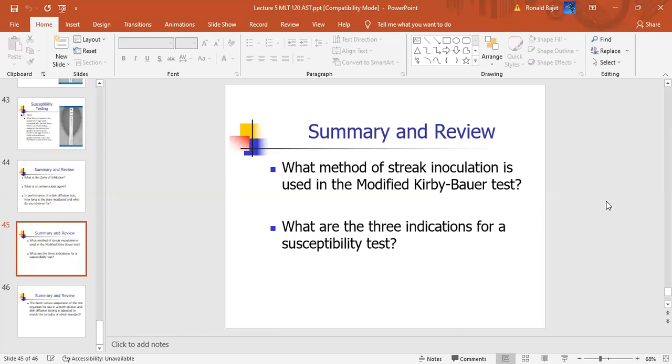So how do you report that if you only have the coagulase test? Do you report it as Staph epi or Staph saprophyticus? No, staph. What do you report to the doctor?